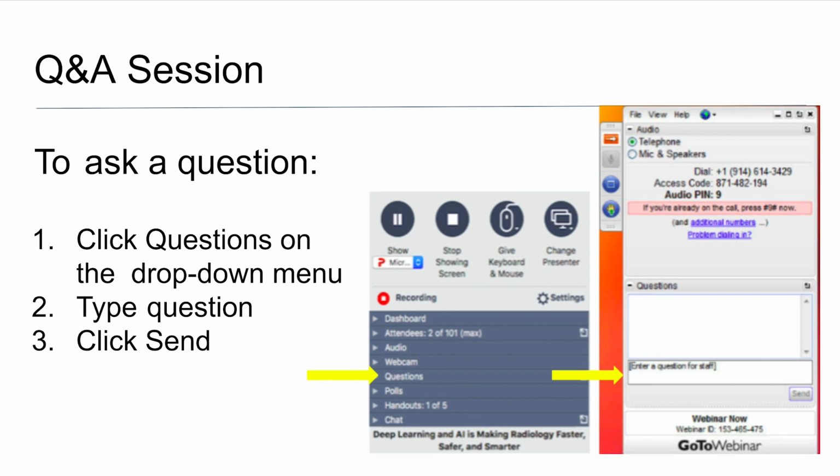Please explain how low dose PET was simulated using full dose data. What is subsampling? I think this is already somewhat answered in previous questions. Basically, because PET has list mode, which is raw events collected, subsampling means you randomly ignore some events. In this way, you simulate as if there were a lower dose or fewer events generated. I think this is the academic and industry standard to simulate it.